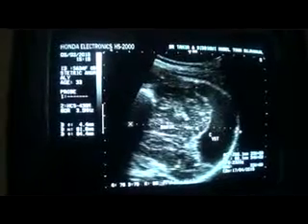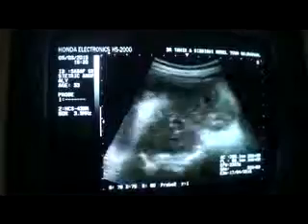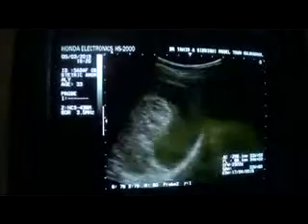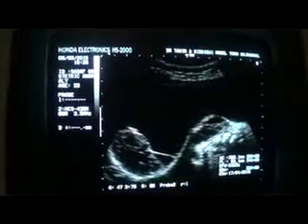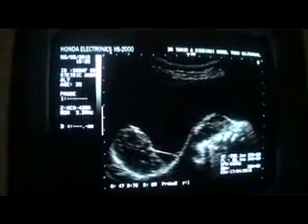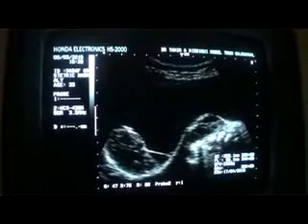Now, another thing to see is where it relates to. Now, when I move the probe, I see its relation with the cephalic part of the cervical vertebra. These are the cervical vertebrae, 1, 2, 3, 4, and this is the middle part of the cyst, which is the meningoencephalocele.